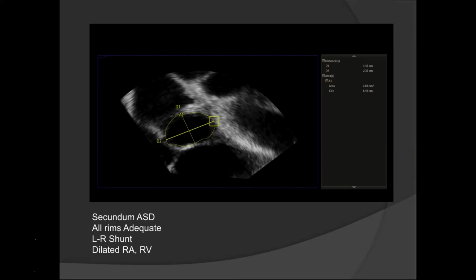Again, we should not stop. In this case, the health checkup was done in a lab setting where a comprehensive health check is done and ECG, echo is also done. So they stopped at reporting RA and RV dilated, but did not report upon the cause of RA, RV dilated, which required further evaluation by transesophageal echo.